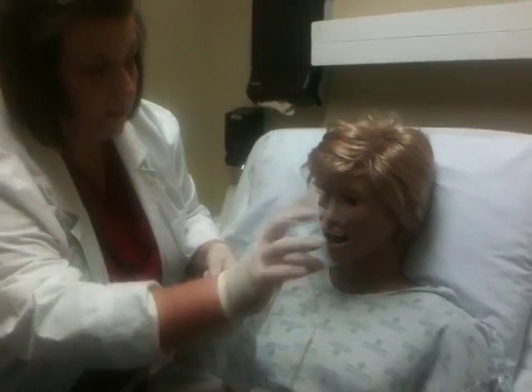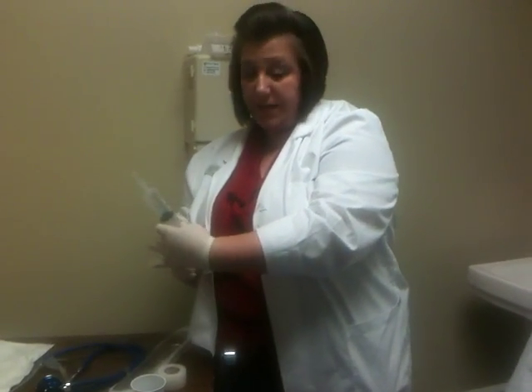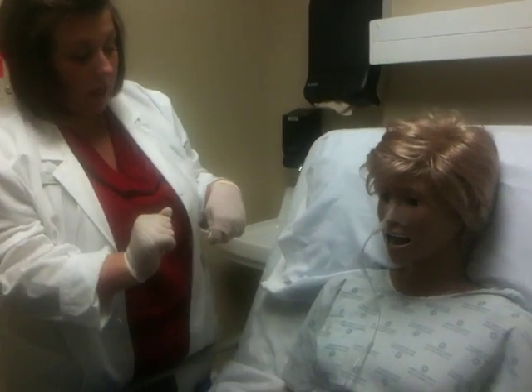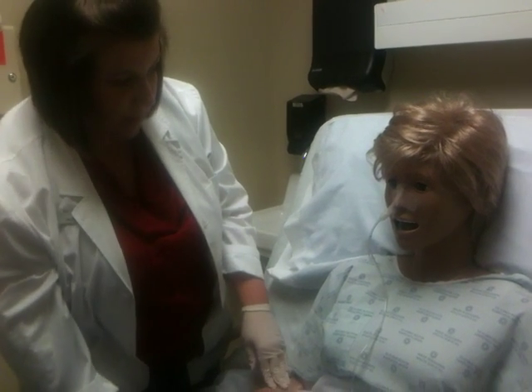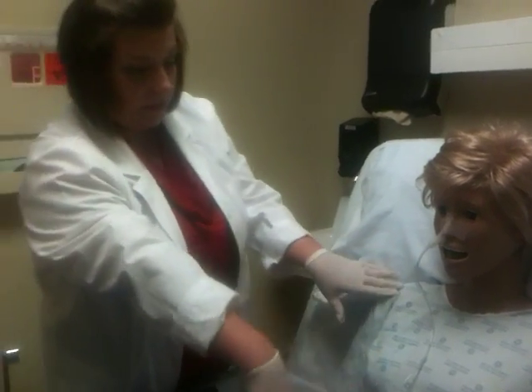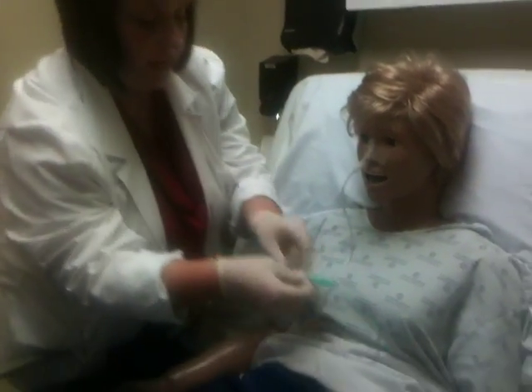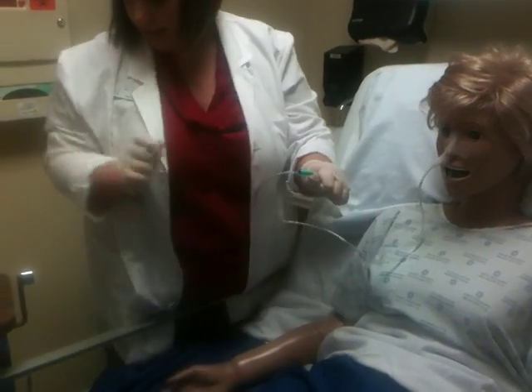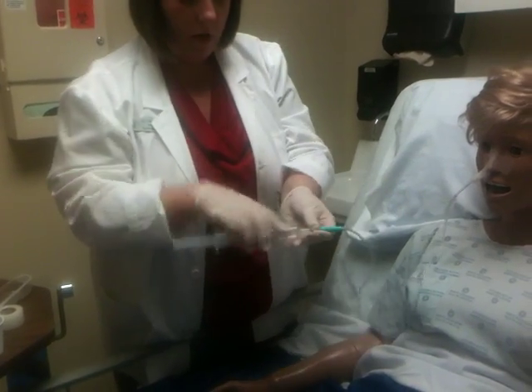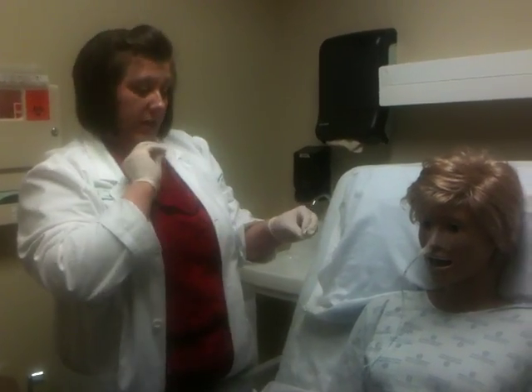Go ahead and you can cut off your suction equipment. You go ahead and draw up 30 cc's of air in your syringe. Put your towel across her chest. All right, Miss Smith, we're getting ready to take your tube out, okay? It's not quite as uncomfortable as when it went down. So I have her towel across here. I go ahead and I'm going to clamp this and unhook it from suction, and put my syringe in here. Go ahead and push in 30 cc's of air. That just clears that tube of any kind of stuff on the end of it.